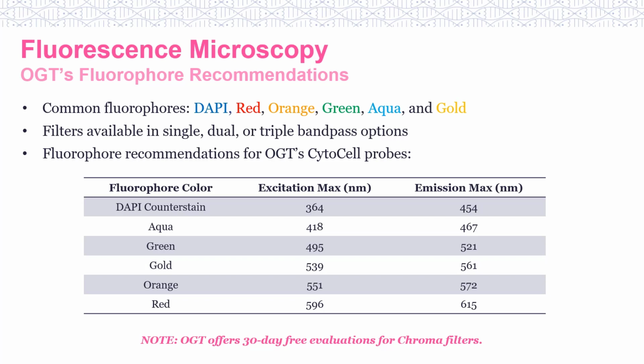The evidence of compliance suggests having a written procedure that specifies the filters being used to analyse a clinical specimen correctly match the probe manufacturer's recommendations.